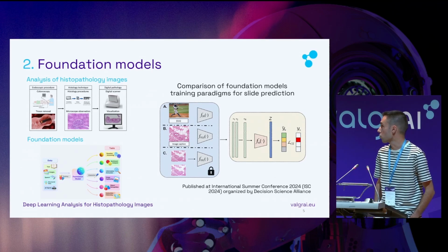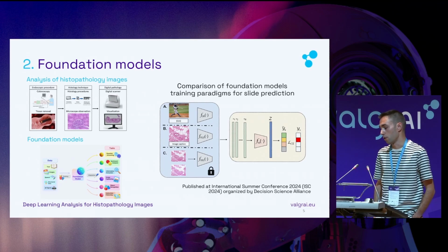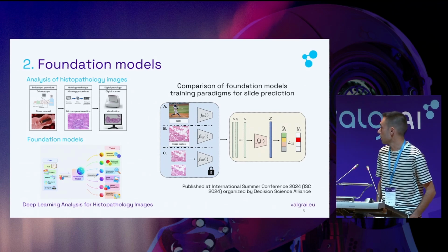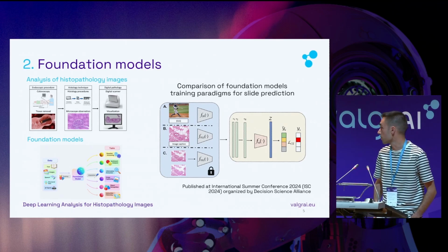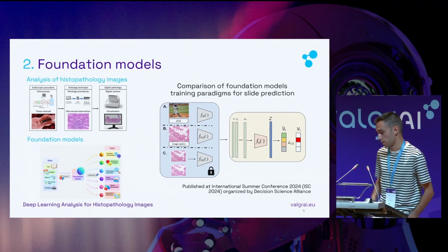Afterward, we compared 2 foundation models which have been trained with in-domain histopathological images. One is trained in a vision-language supervision paradigm, where the model learns the features from text supervision, and the other one uses a self-supervised learning paradigm performed in an unsupervised manner based on contrastive learning.